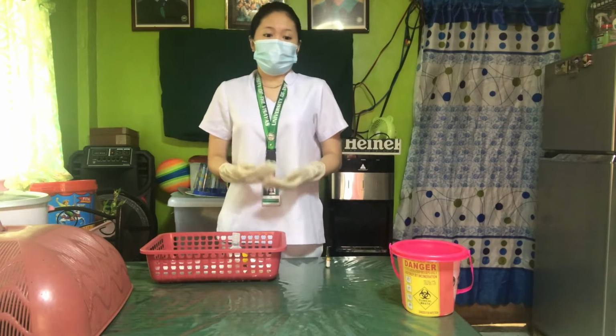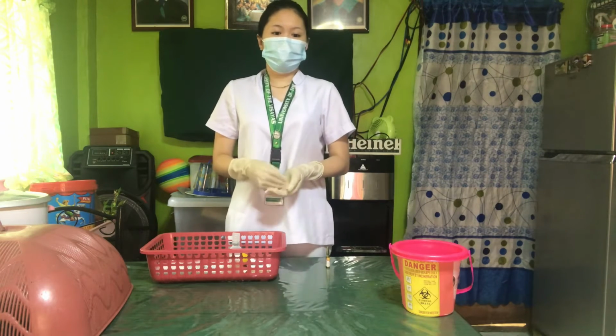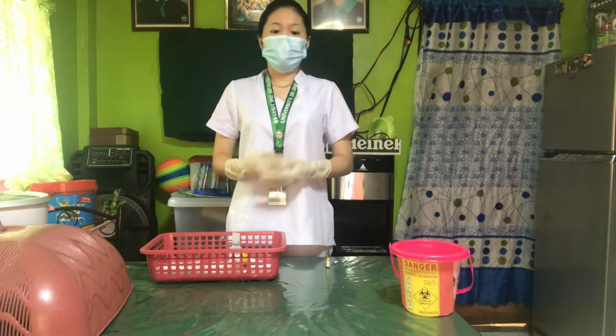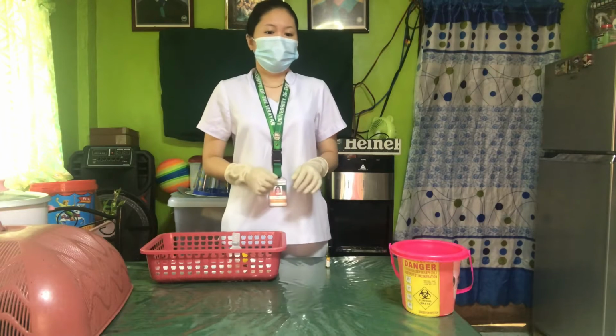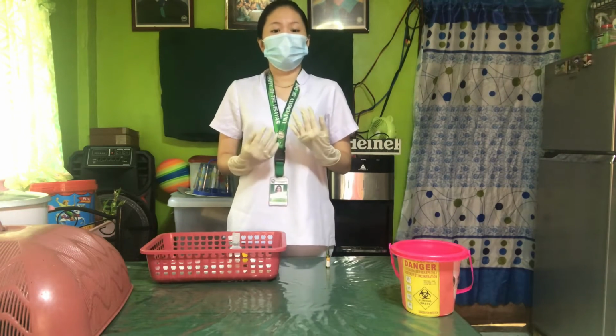Next is place a piece of sterile gauze between your thumb and the ampule neck. The gauze shields the nurse's fingertips from the shattered glass and any particles shower away from her.